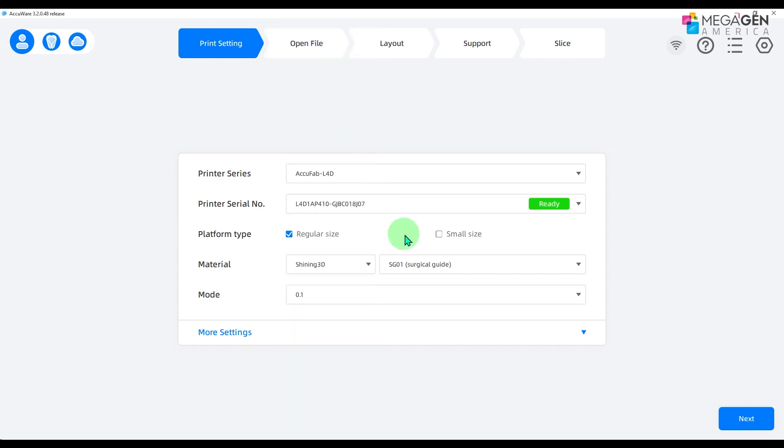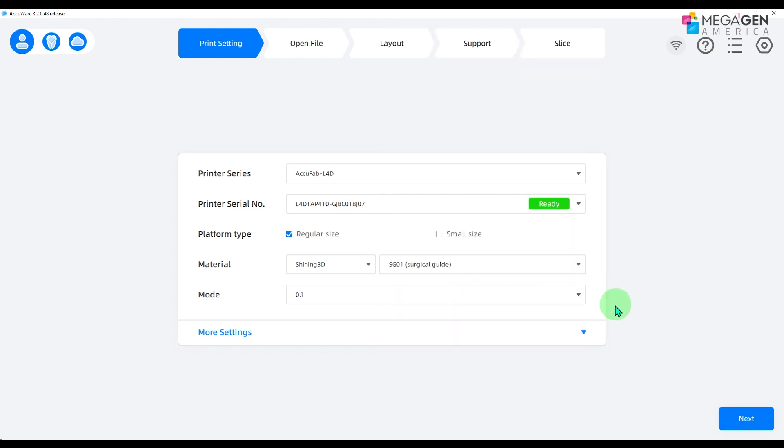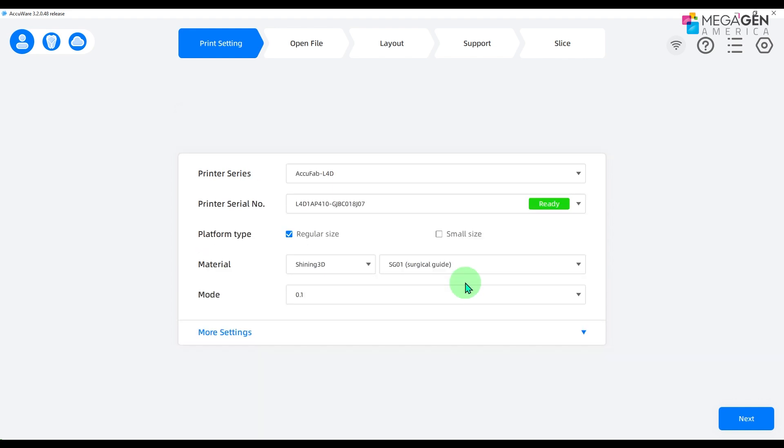Choose the material brand and the type of resin. The good thing about Shining 3D printers are the automatic configurations. So if you purchase the compatible resins, the values are in the system.